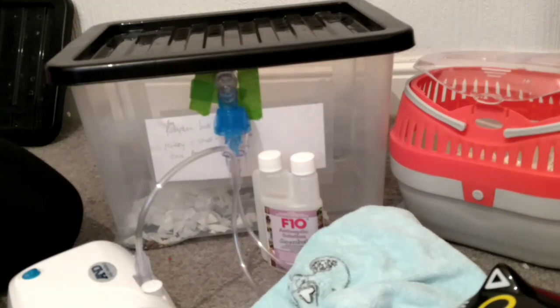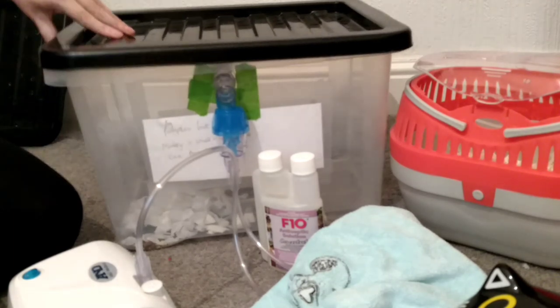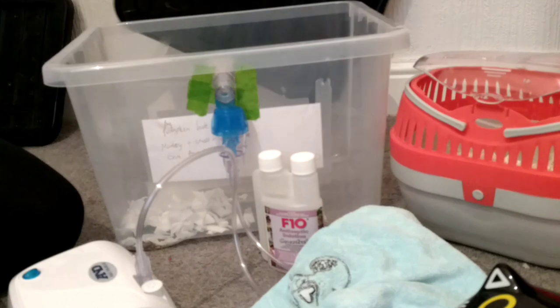That's basically it — that's all you need. Good luck if anybody else ever has to go through this. I put bedding along the bottom with a plastic hide, and once the treatment had finished I would just leave the lid off to make sure the bedding was totally dry and wasn't going to go mouldy from the vapour. This seemed to work quite well.